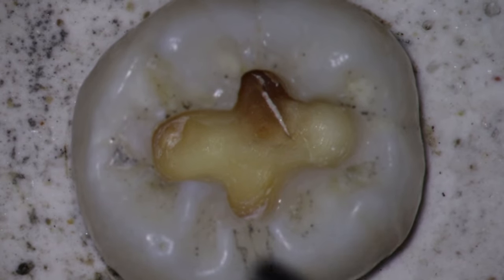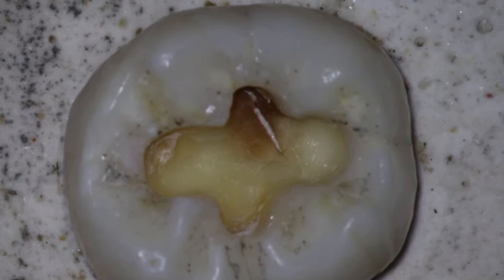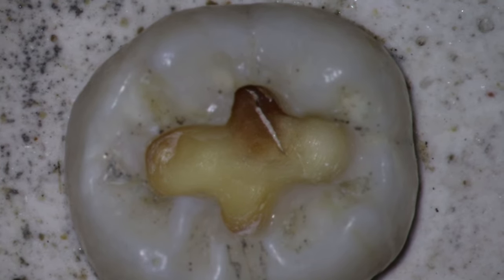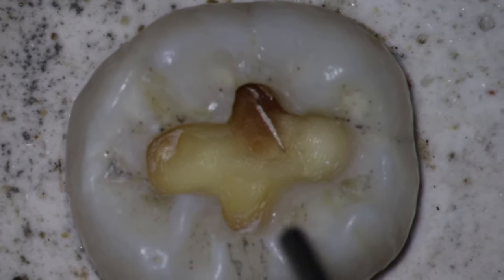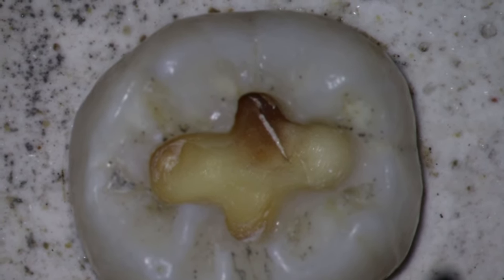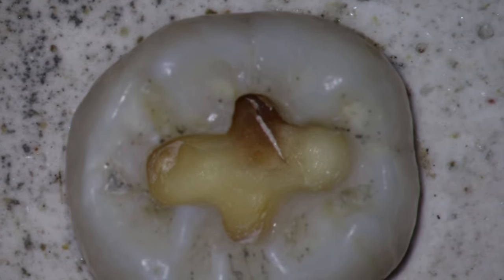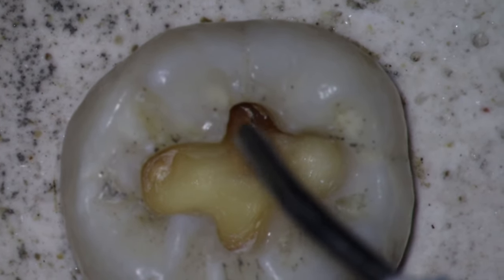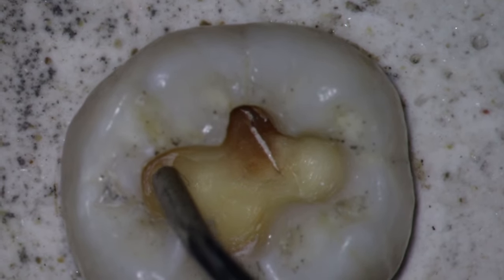So what this etchant does is that it removes the smear layer, it etches the enamel and dentine. And whenever you use etchant with any bonding agent system, that is called as total etch technique, when it is applied to enamel and the dentine. So here now I am applying the etchant.